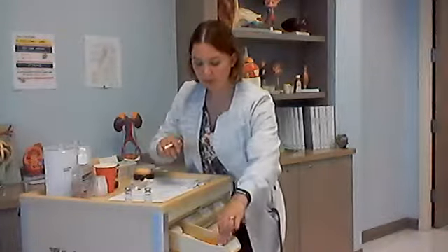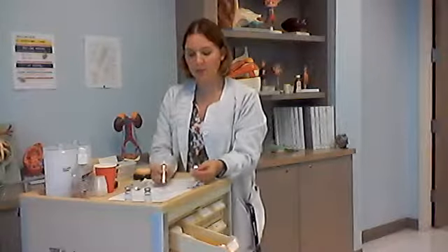My last one is my tuberculin purified. This will not have a patient's name on it. This is a universal vial, but you still have to check you have the right patient. So I have Terrence Walker, 15461. Now I'm going to check my drug, tuberculin purified, 0.1 milliliters, intradermal. Time is now. I'll document at the end. So my first check on all my medications is completed.